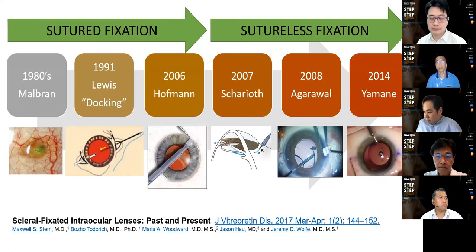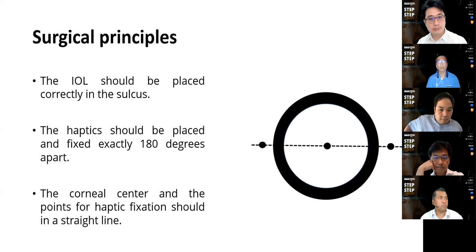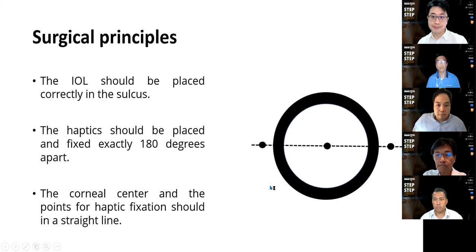Okay, now I will go to the actual part of my talk. Whatever method you choose to fixate the IOL to the sclera, there are certain surgical principles that we have to follow. First of all, the IOL should be placed at the sulcus. Why? Because this is the physiological place for the IOL to be, and that will give the optimum visual correction to the patient. And how to achieve that is by fixating it 2 millimeters posterior to the limbus.